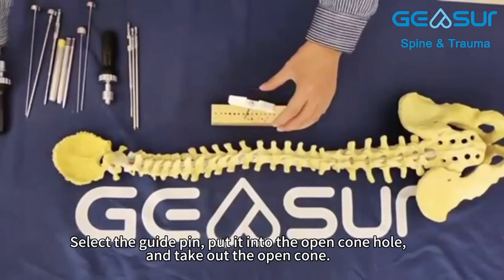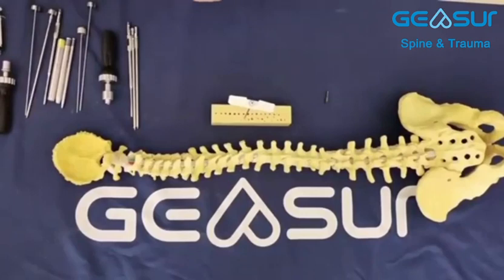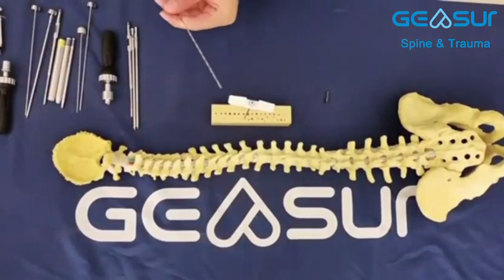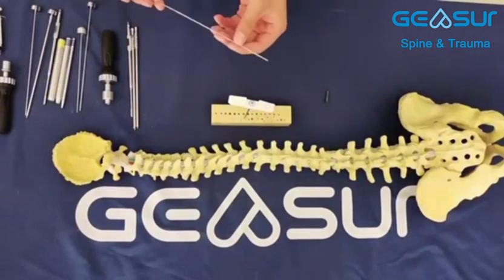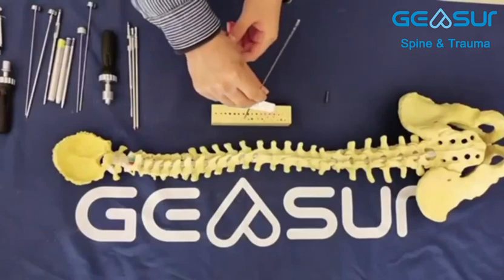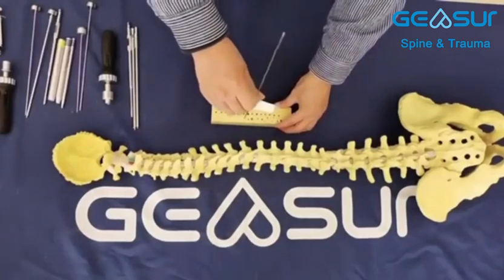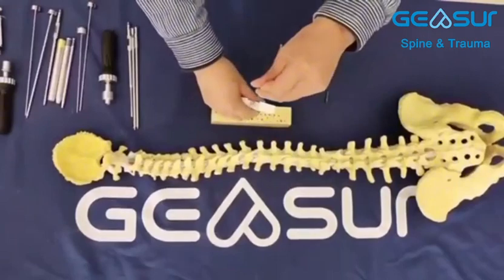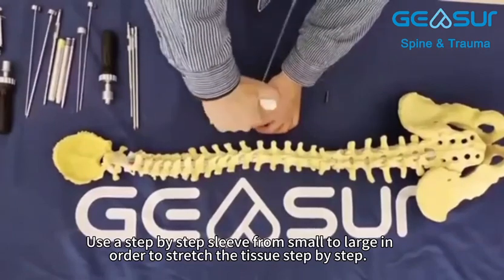Select the guide pin, put it into the open cone hole, and take out the open cone. Then use a step-by-step sleeve from small to large in order to stretch the tissue step by step.